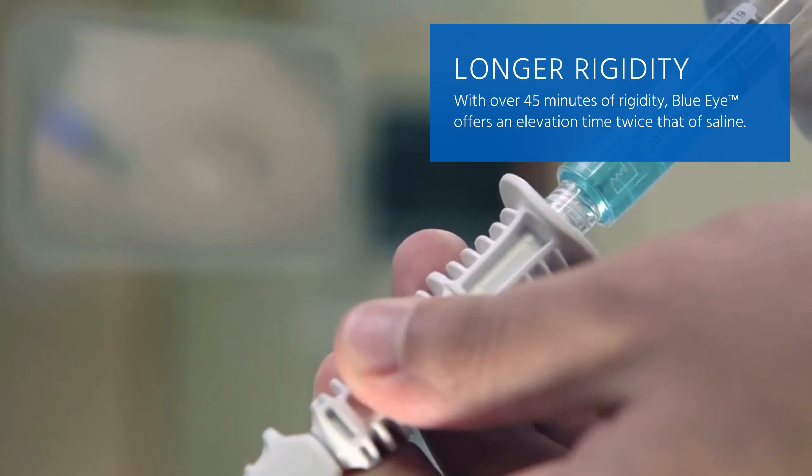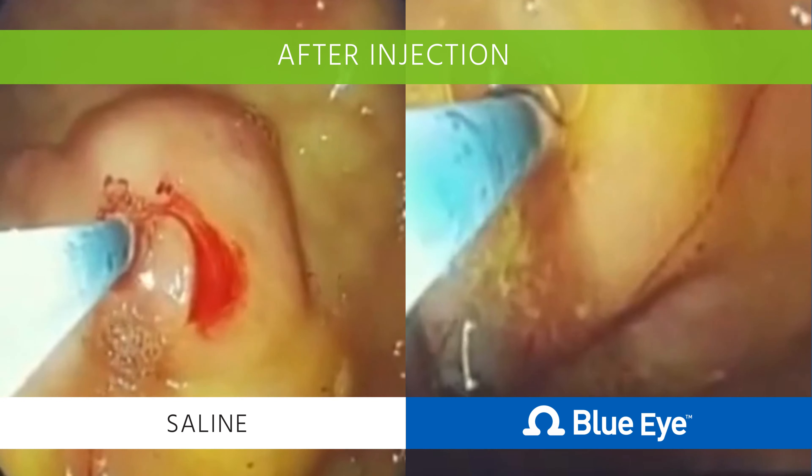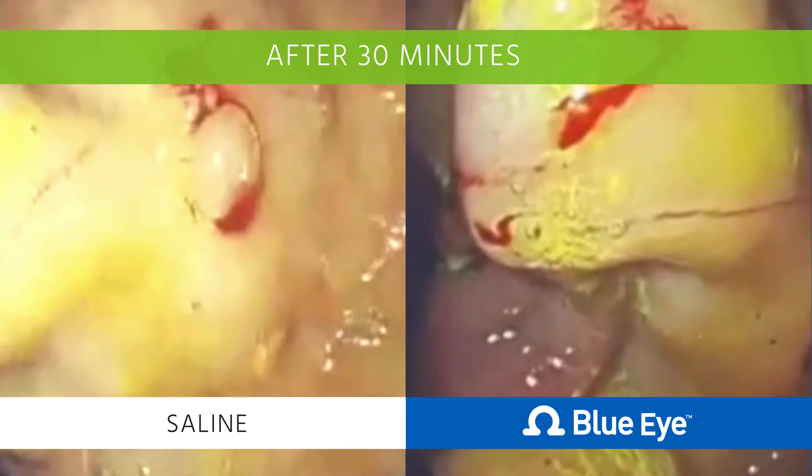With over 45 minutes of rigidity, BlueEye offers an elevation time twice that of saline. Longer rigidity times reduce the risk of complications. Even after 30 minutes, BlueEye maintains superior rigidity.